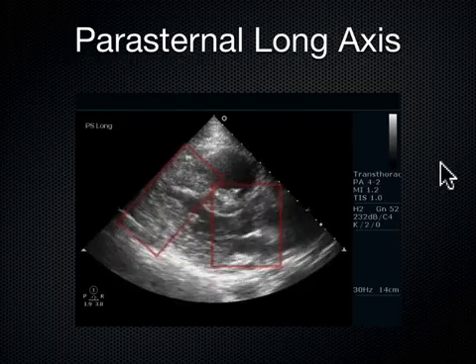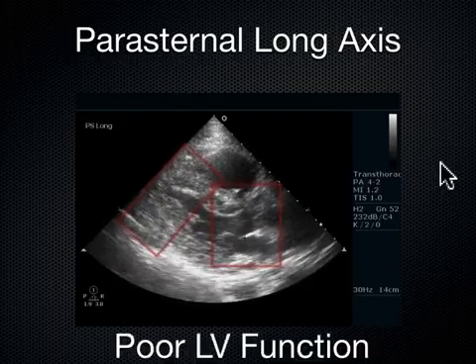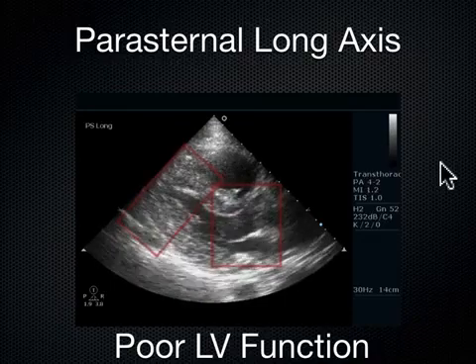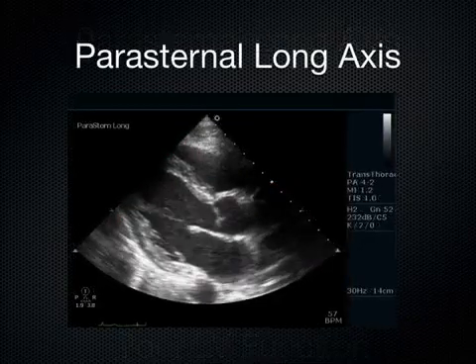So this patient had very poor LV function, but when we were able to give this patient some thrombolytics, that cleared up that blood clot, blood got back to the lungs, and this patient actually had a pretty decent outcome. What about this one here?